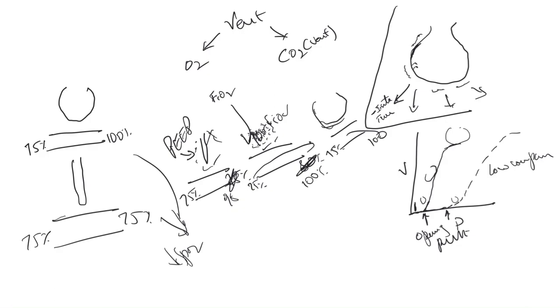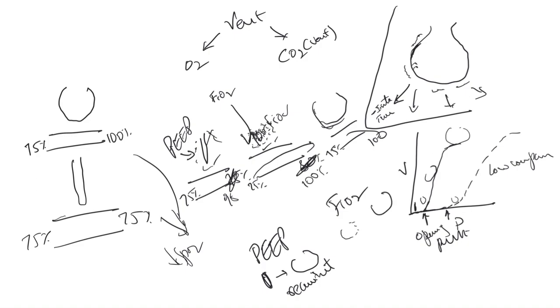So in any vent, you are going to set PEEP. This is to pop open those alveoli that are collapsed, to open them, also called recruitment. And you're also going to set FiO2. FiO2 is for those alveoli that are open, but they are small. You're going to increase the amount of FiO2, so 21% to whatever FiO2 you set. I just said 100 so that it's easier to understand. So these two are the components of any ventilatory mode, and that deals with the oxygen part.